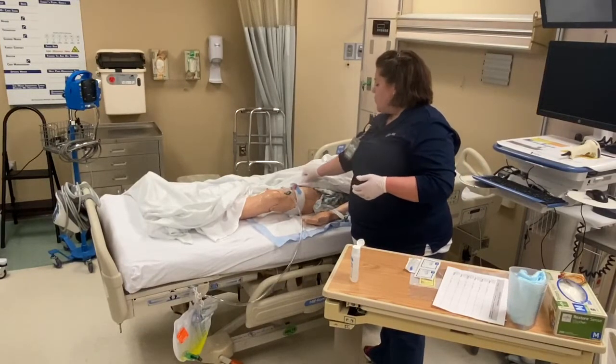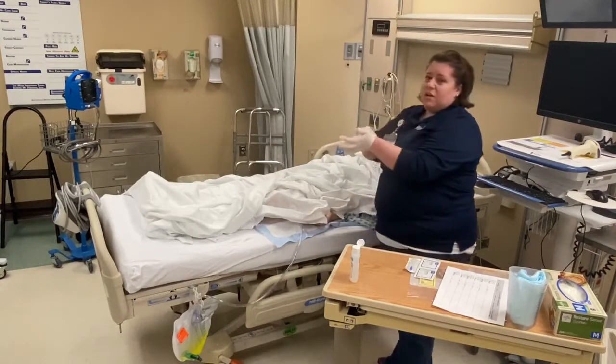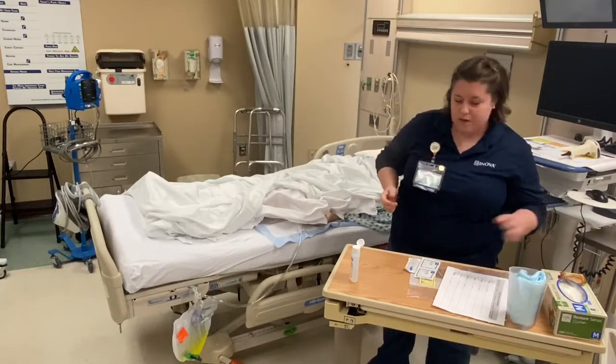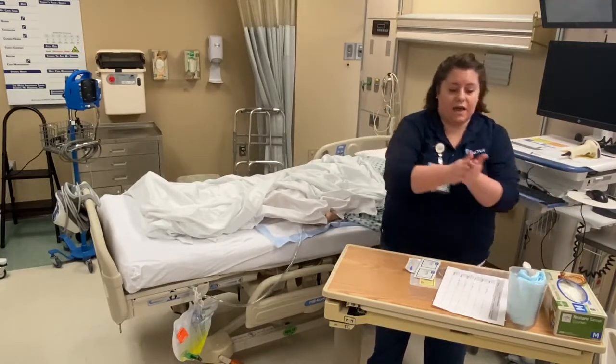Okay, so at this point, I can cover my patient up while we're waiting for the urine. I'm gonna take my gloves off because now they're dirty. I've touched the urine tubing. I'm going to wash my hands and I'm going to prepare my supplies.